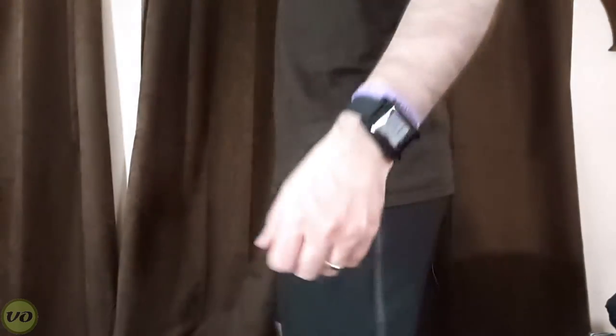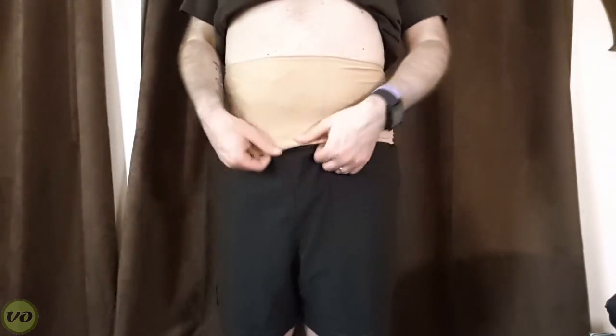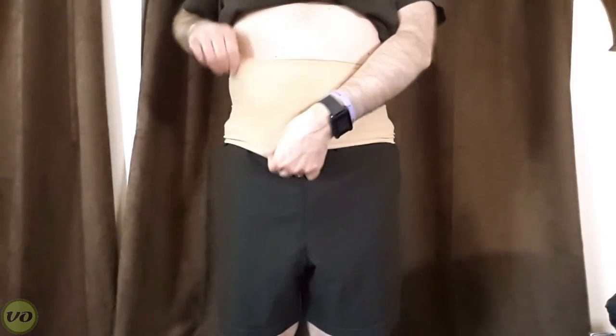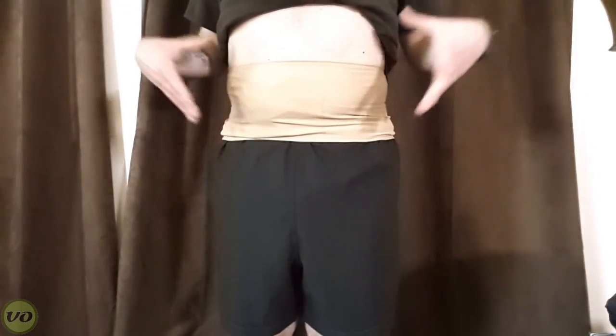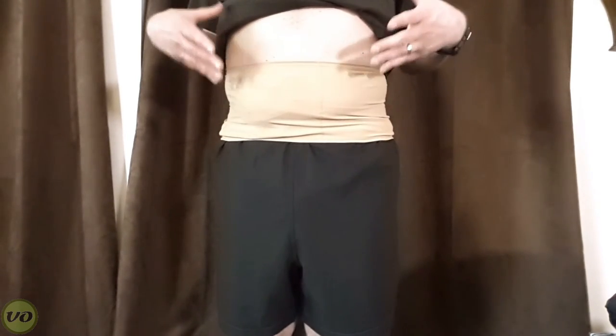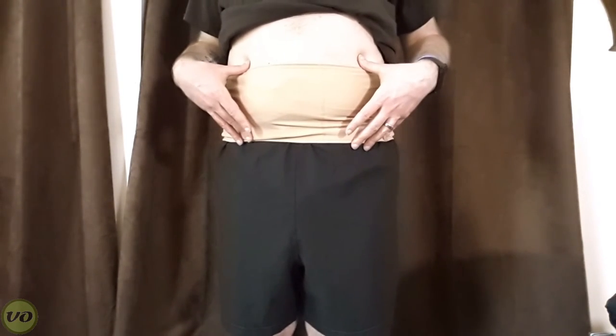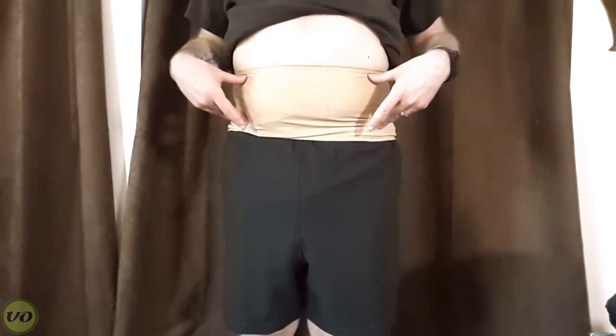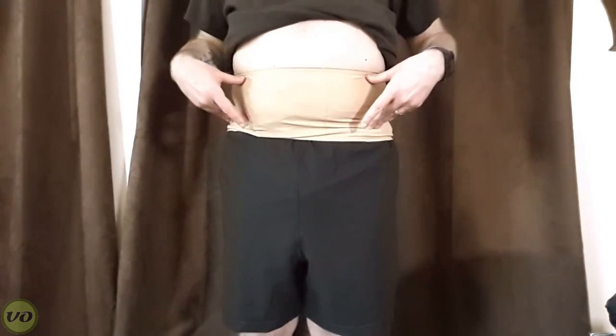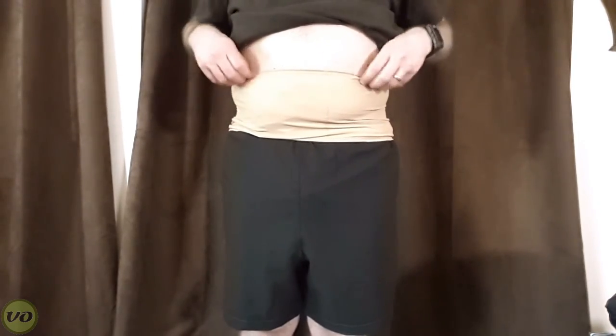When it's underneath your clothes it's also nicely hidden. I would also mention that because this wrap is so thin and light compared to the classic wrap, I would consider using this as an intimacy wrap — it's quite a bit more comfortable versus some of the thicker wraps. So it's not just for swimming.